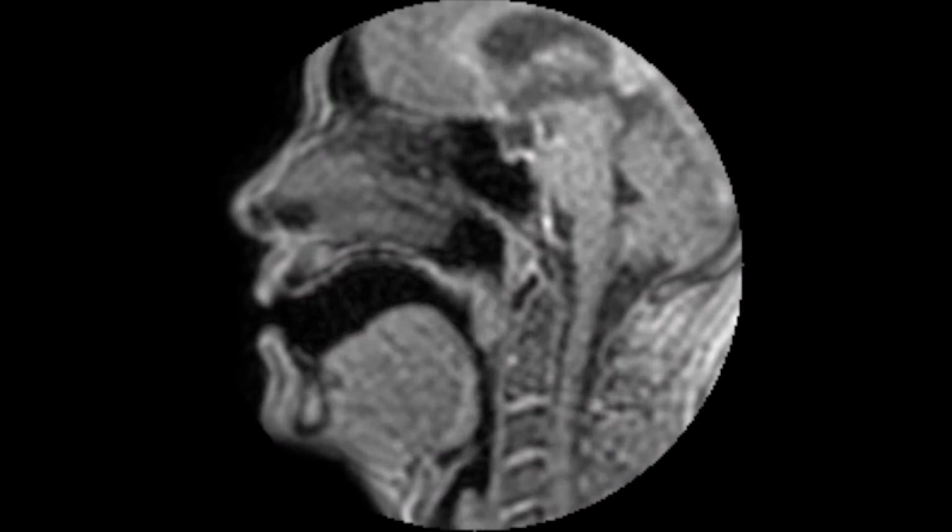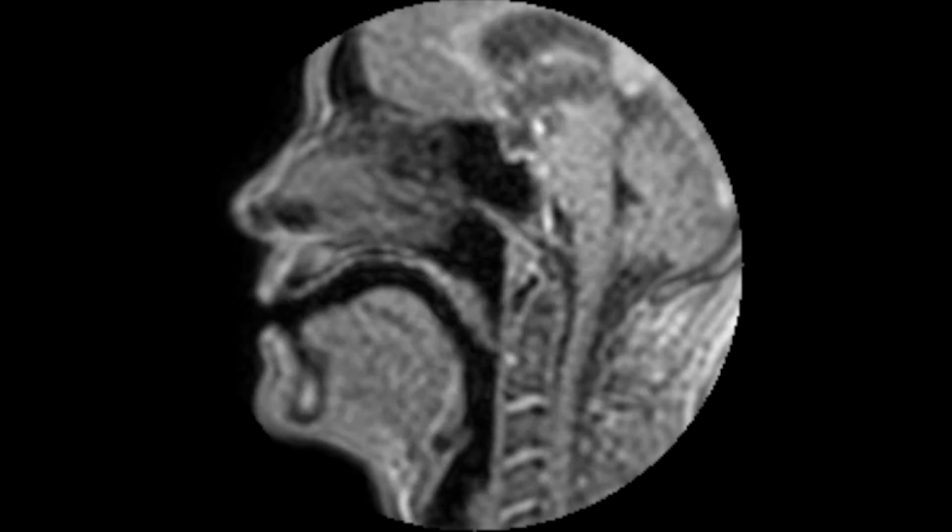As my colleague Mark already mentioned, one of the goals of our project is to improve temporal resolution, or the speed of the imaging, and the quality of the imaging as well. The problem with MRI is that it's a very slow technique to acquire the data. It just takes time, and there's a trade-off between the time it takes to acquire the data and the quality of the image in the end. Traditionally, MRI data is acquired in a Cartesian grid, line by line, as you will see in the example image.